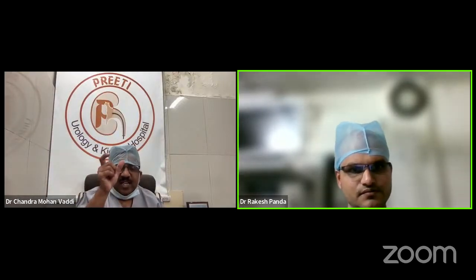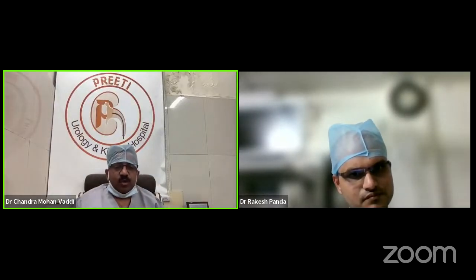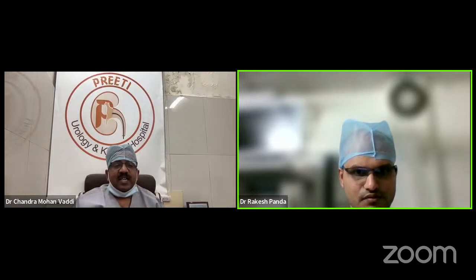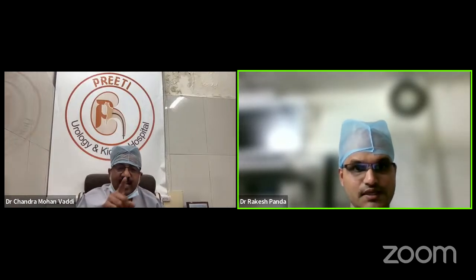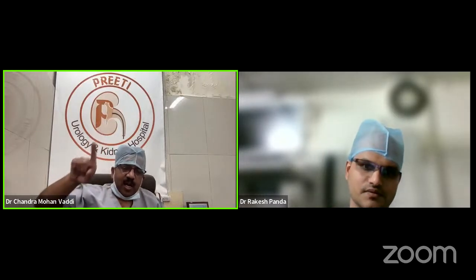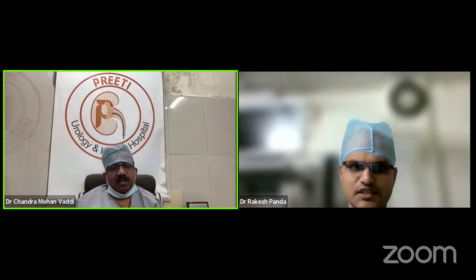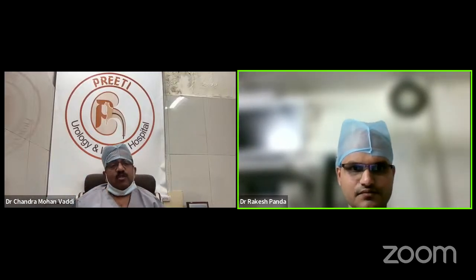What is the condition where this type of stones will be there? Lower, middle, upper, and kidney stones. So, retained stent. In that retained stent condition, you have to do cystolithotripsy, ureteroscopic lithotripsy, RIRS lithotripsy, PCNL lithotripsy. Ideal case for ECIRS and supine PCNL.